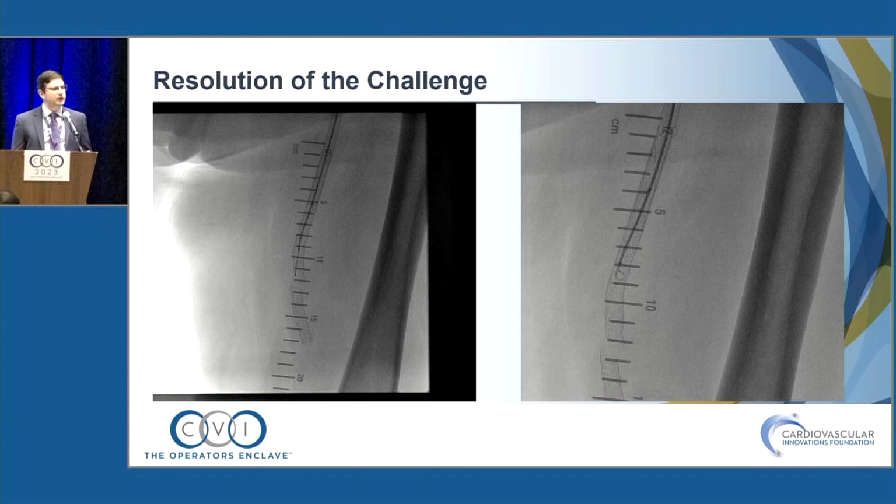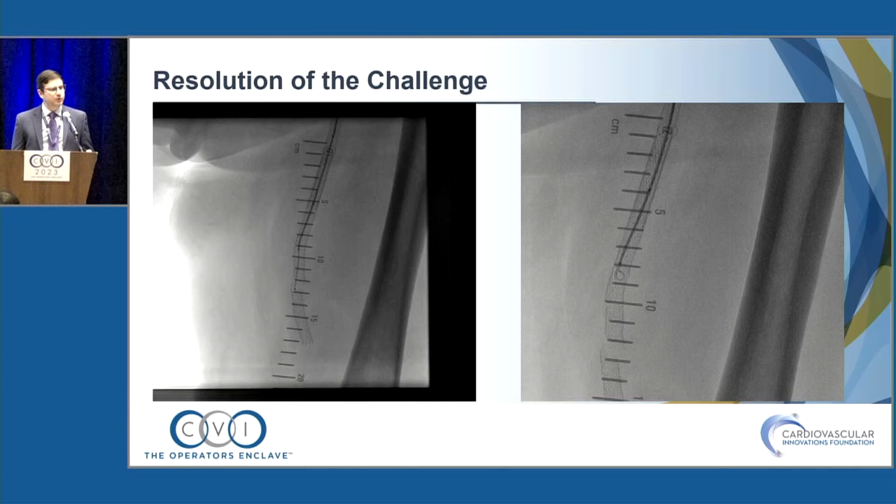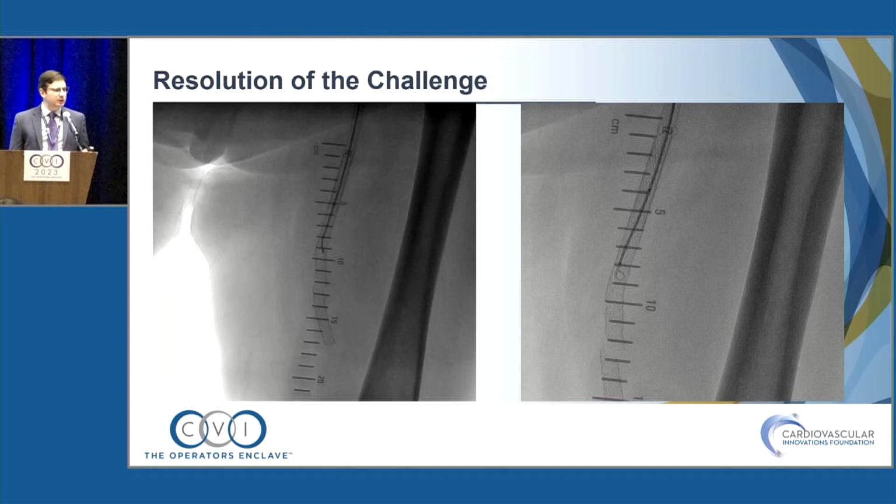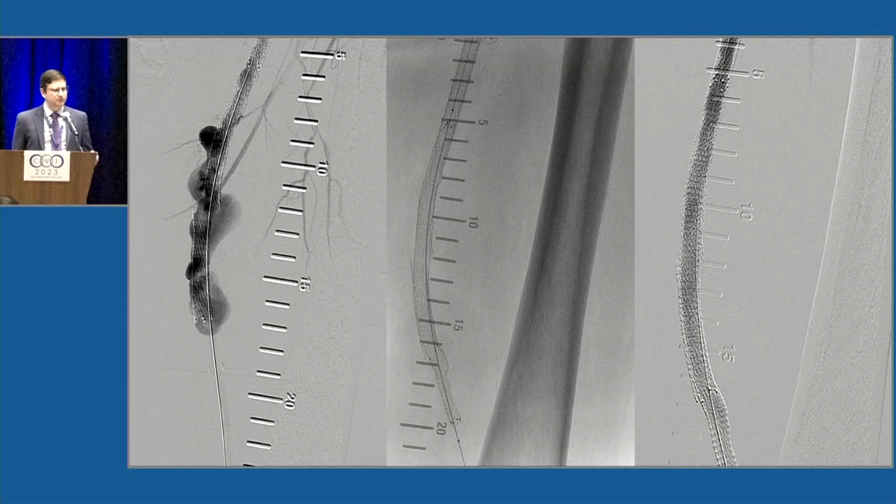And so here we see the angiograms from the fix of the pseudoaneurysm. So initially just trying to go in with a straight wire, difficulty traversing the area of fractured stent here. And so he went in with a Rosen wire here that passed the area through the comminuted stent fracture too. You can also see that just in the 6 months since the original CT, just how much more discontinuity in that area of stent fracture is. And so obviously this is something that warranted repair in this case rather than monitoring.